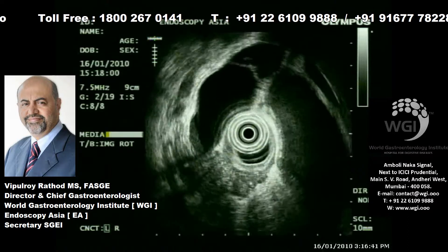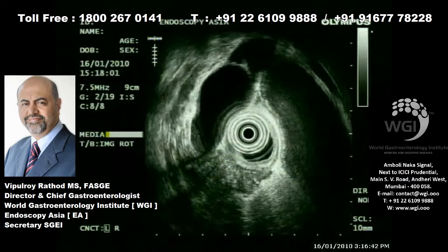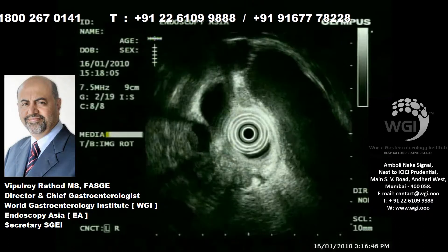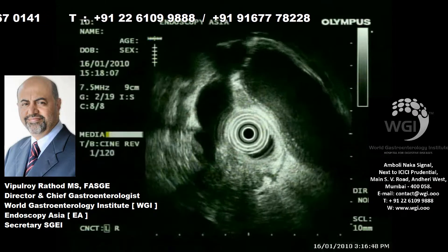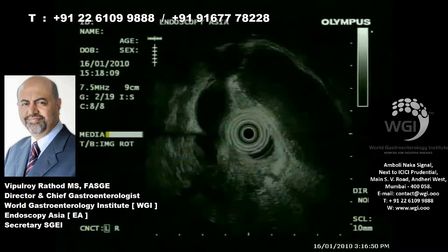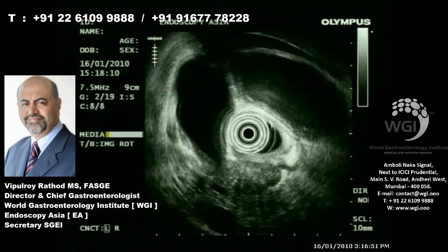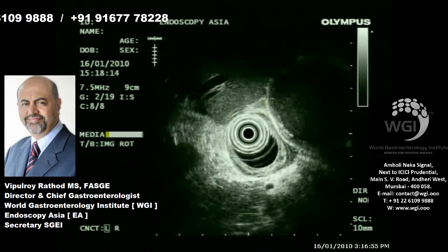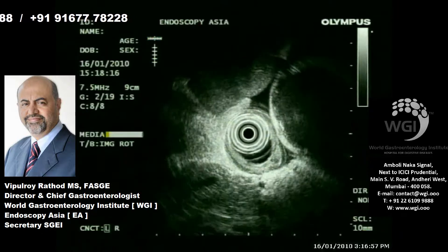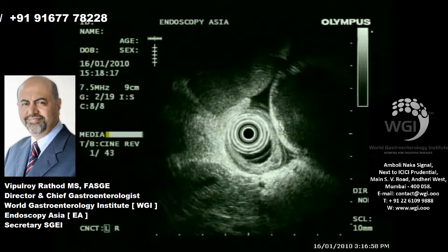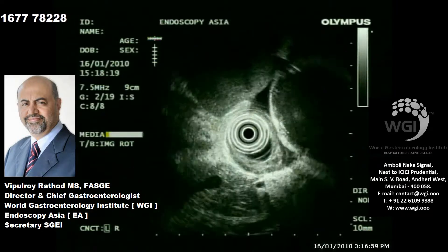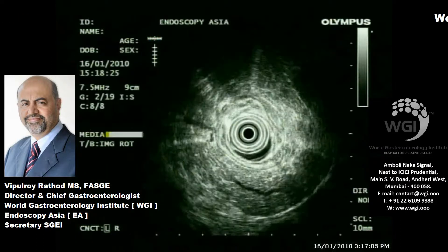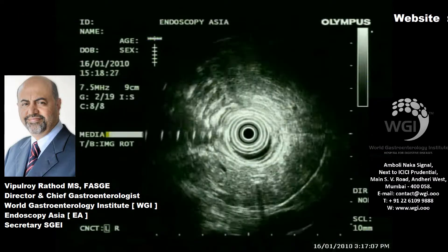You can see the free fluid pocket at the 12 o'clock position. This heralds a very early peritoneal dissemination. Of course, it can be debated whether we always need to do EUS-FNA of a small pocket of fluid, but when we know that these patients have high comorbidities and require definitive palliation, diagnosis, and staging, it does not really matter.